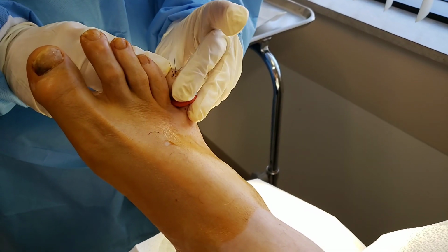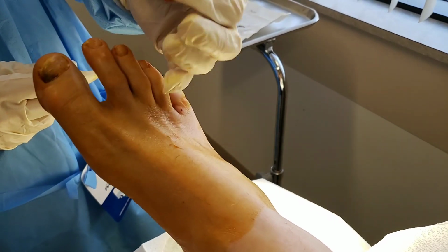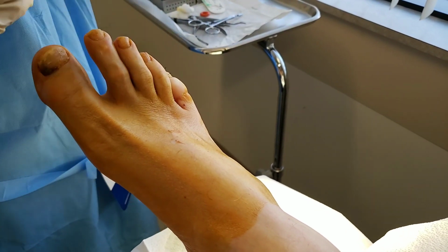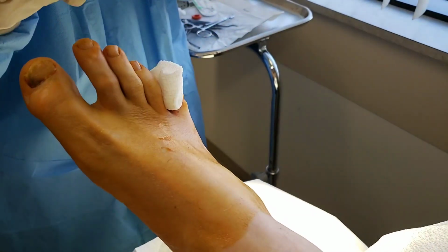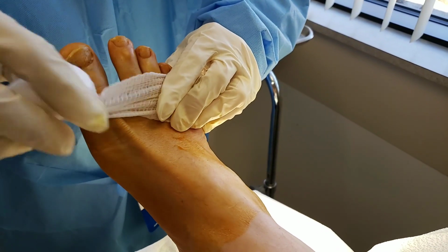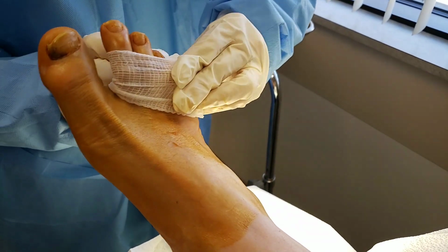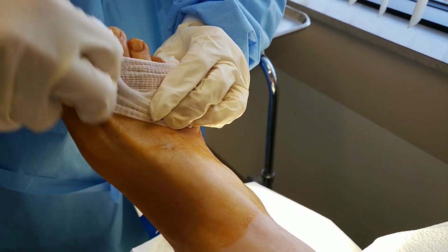So everything's nice and closed. That's the tourniquet. You want to make sure you take those things off. And sometimes these bleed a little bit. So we put a little dressing. He's just going to leave this dressing on for maybe 2 to 3 days. And then just put some gauze and a Band-Aid around it.